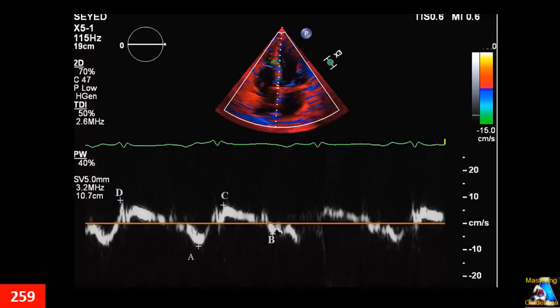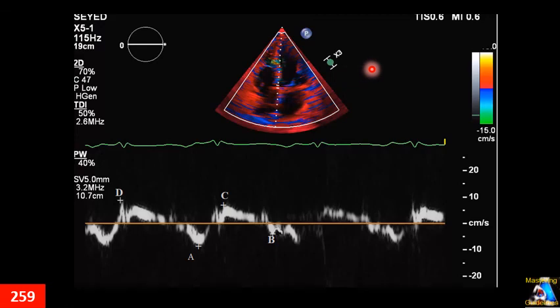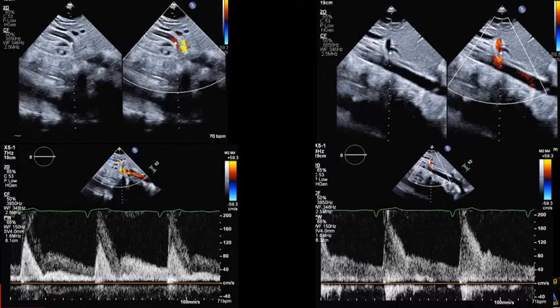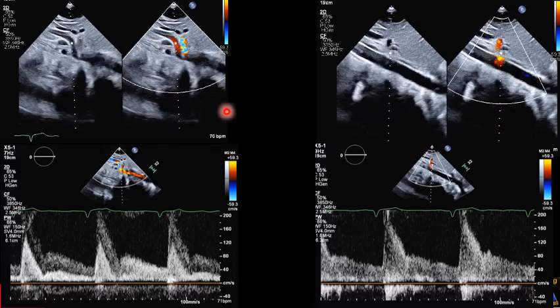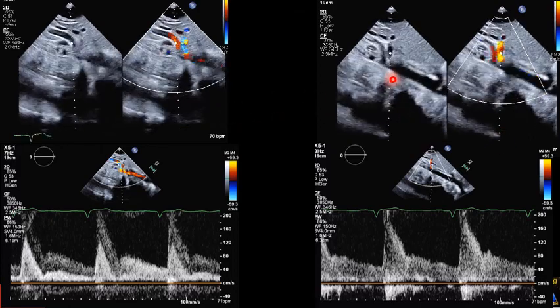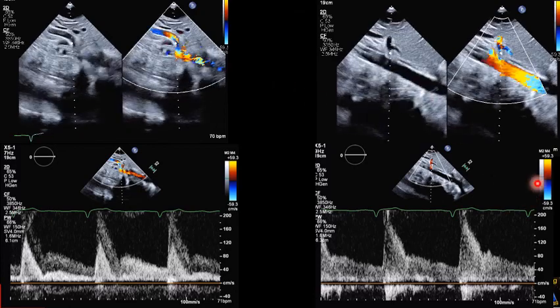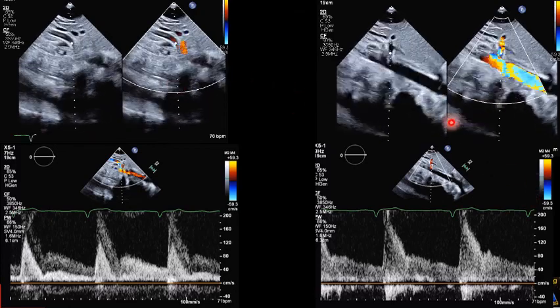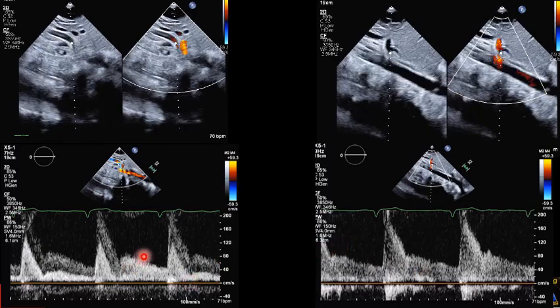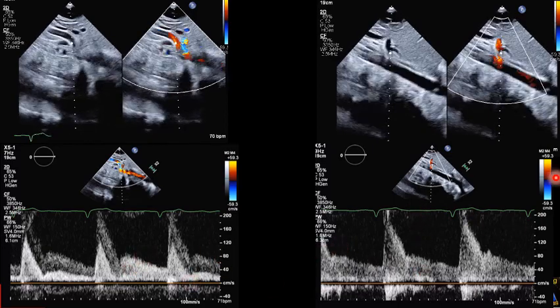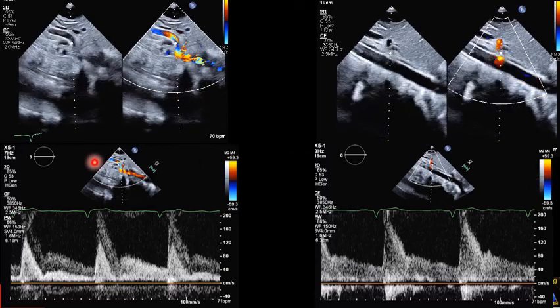You are doing tissue Doppler at the medial annulus and you get this Doppler. Where exactly are the measurements for E prime, C prime, and A prime — especially for E prime? Here we have a patient with PDA. We do at least one of these two studies, and what does each study tell you? Based on the findings on the Doppler, what grade of PDA does this patient most probably have?